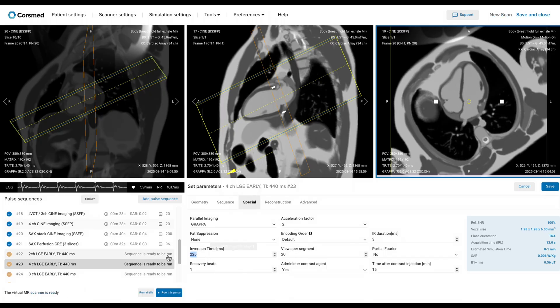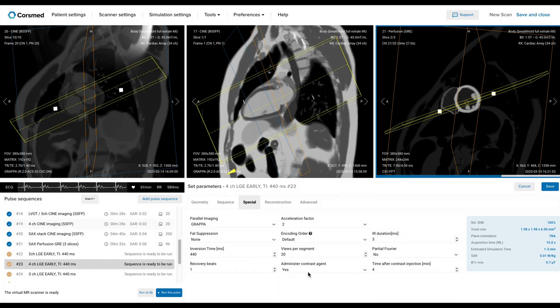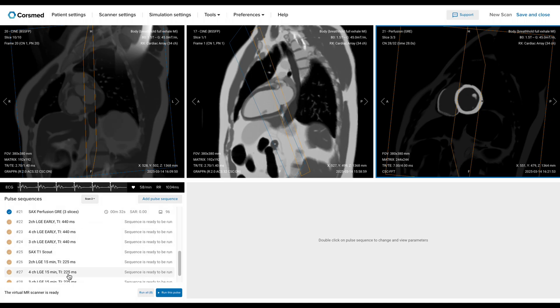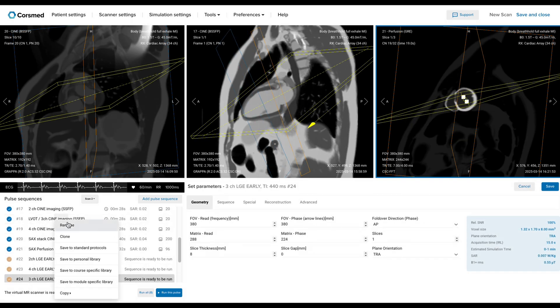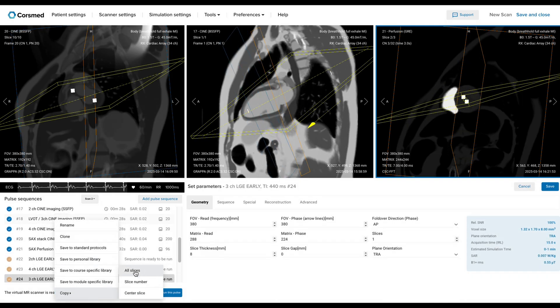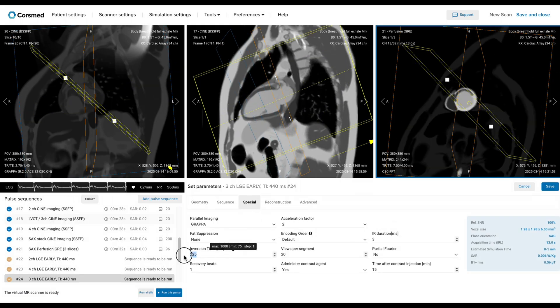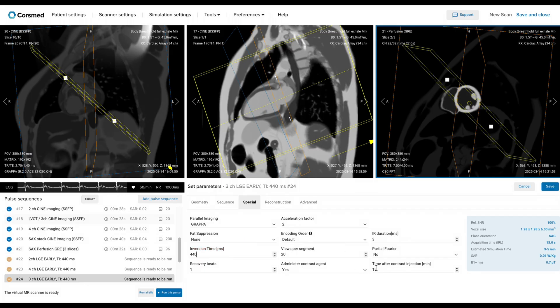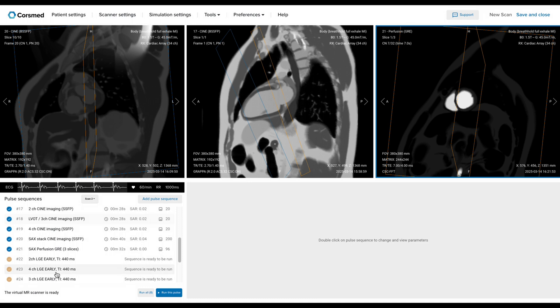Then I'll change our inversion time. I will do the same thing again for our three-chamber view — copying the slice position from our previous Cine sequence. I'll set the inversion time to 440 and time after contrast to 4 minutes. We can now save and run this pulse.